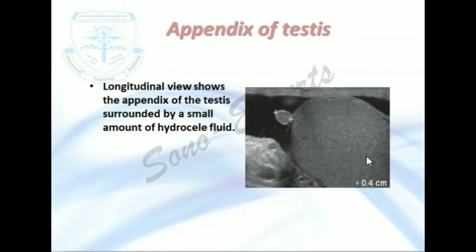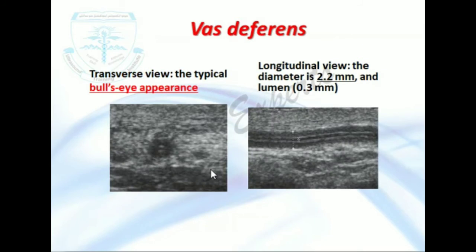Another structure is called the appendix of the testes. This is the testes, this is the upper pole, and here a small tissue is attached to the testes surrounded by fluid, which is a hydrocele. This is the vas deferens. This is the tube in longitudinal view. This is the transverse view, which appears like a bull's eye.